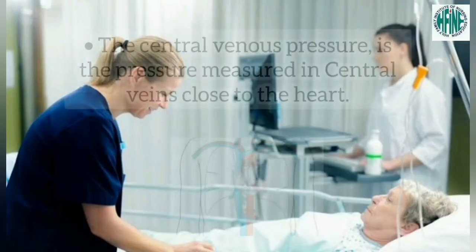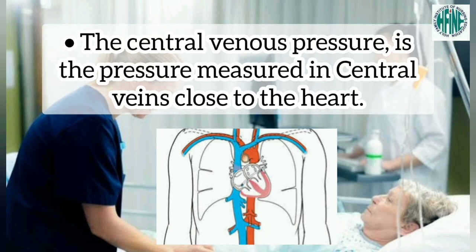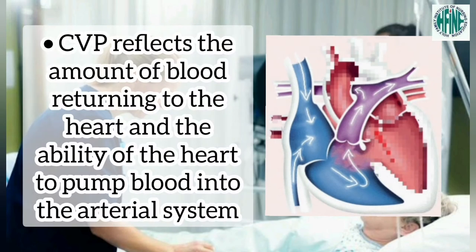Introduction. The central venous pressure is the pressure measured in the central veins close to the heart. CVP reflects the amount of blood returning to the heart and the ability of the heart to pump blood into the arterial system.